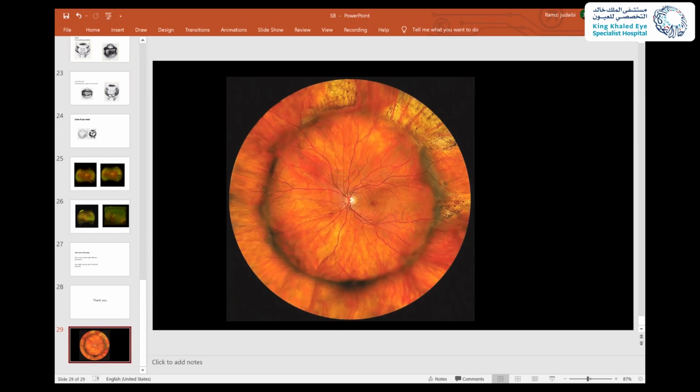The disadvantage is that you need to open the vitreous cavity. But honestly, in classic buckle with indirect ophthalmoscope, after we tighten the buckle, we usually do paracentesis, AC paracentesis, to deflate the AC and reduce the intraocular pressure. So for me, it doesn't have a big issue to fix a chandelier light and to gain the great advantage of better visualization under the microscope and give the same chance for the trainee to have the same vision.